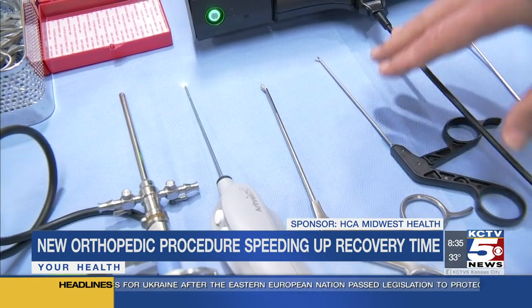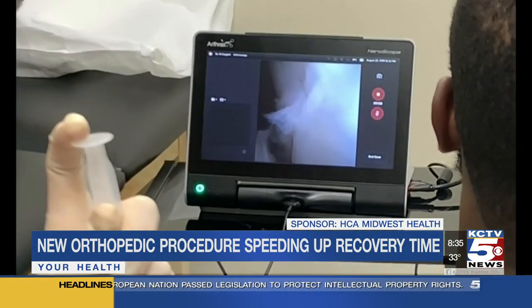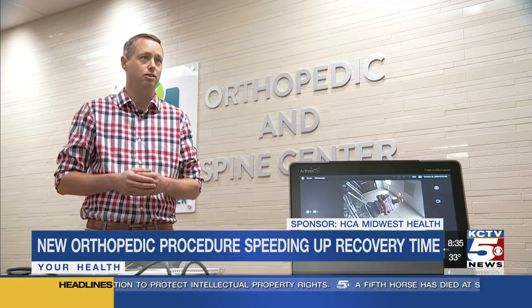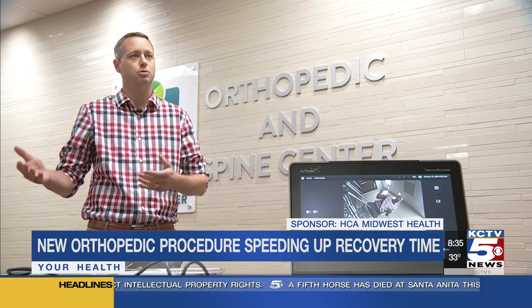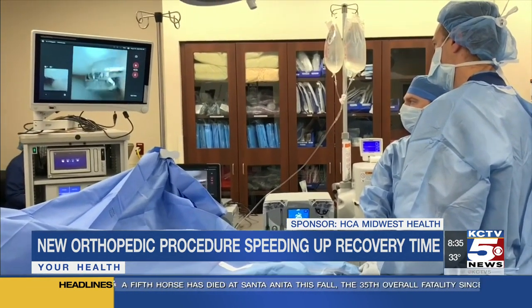Dr. Daggett says the less invasive, the better the outcome. Being able to do things through a needle-sized instrument instead of a large incision, or even the standard arthroscopic incision, is going to equal less tissue damage and less pain. And getting back to a pain-free life happens even faster.